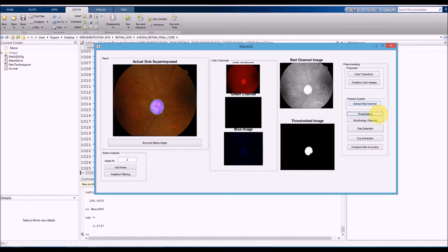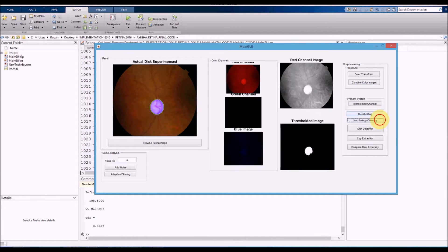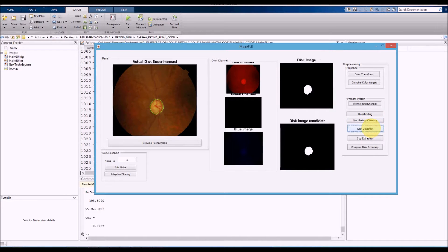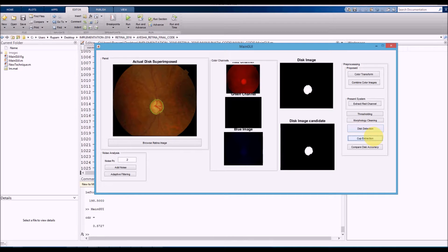We perform thresholding on the red channel. The rest of the steps remain the same: morphological processing, detect the disk area, detect the cup area.